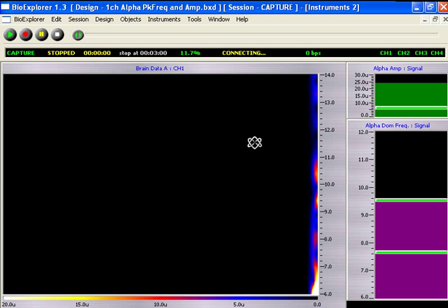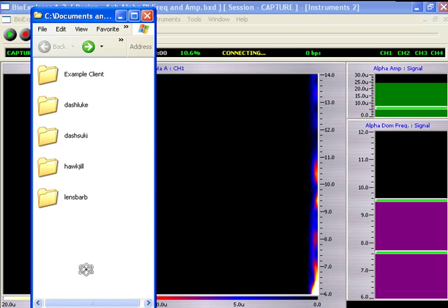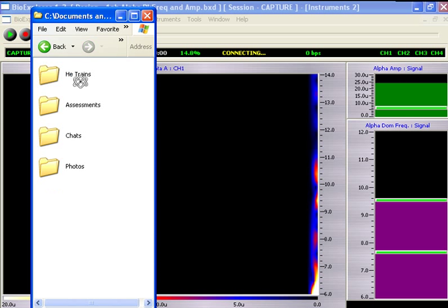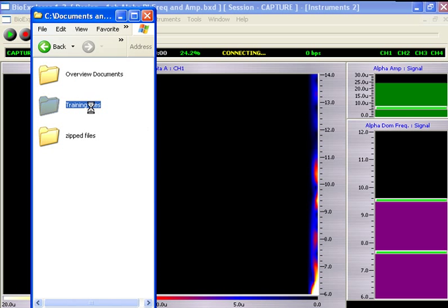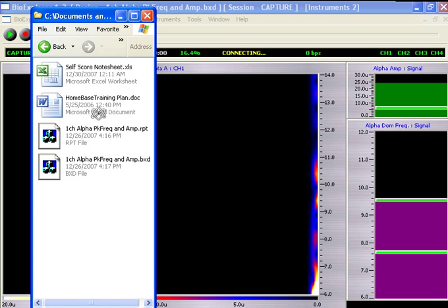Before setting preferences for automated file saving, we need to have created our target folder where data files will be directed. Here's our sample client folder with training folder where we'll save our files.